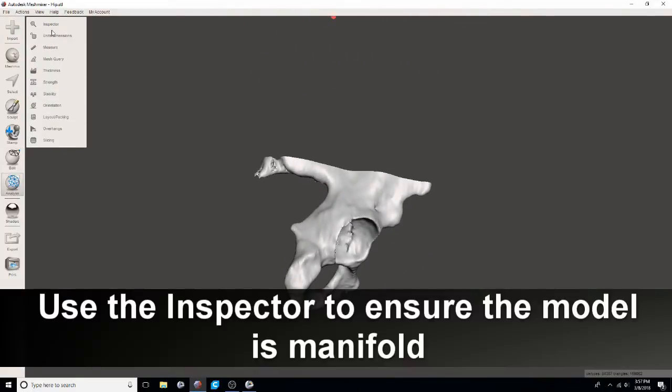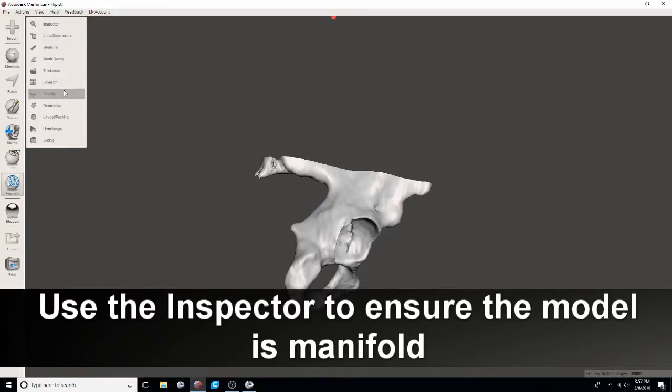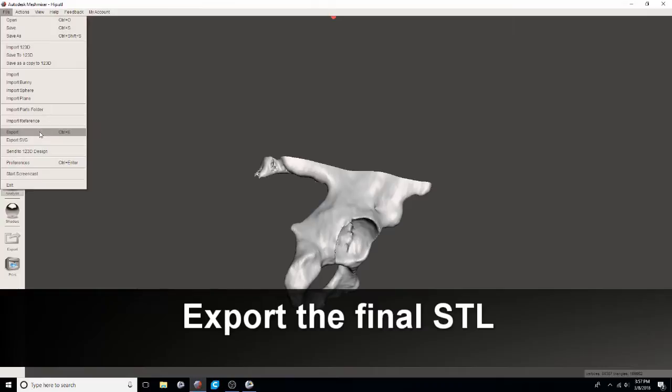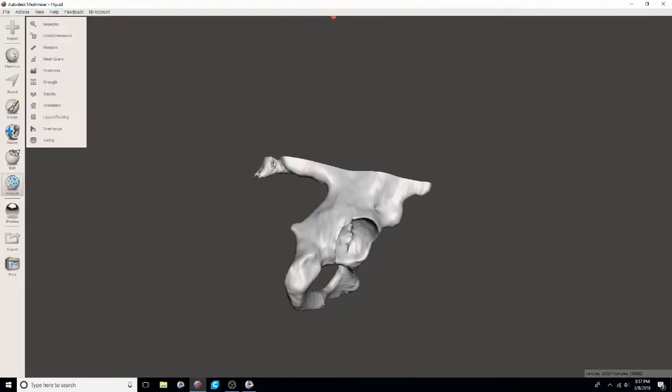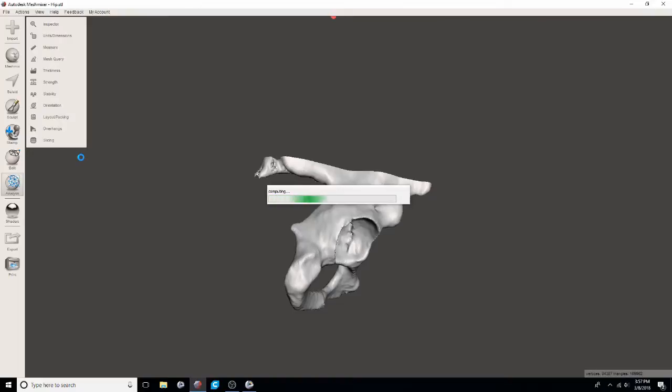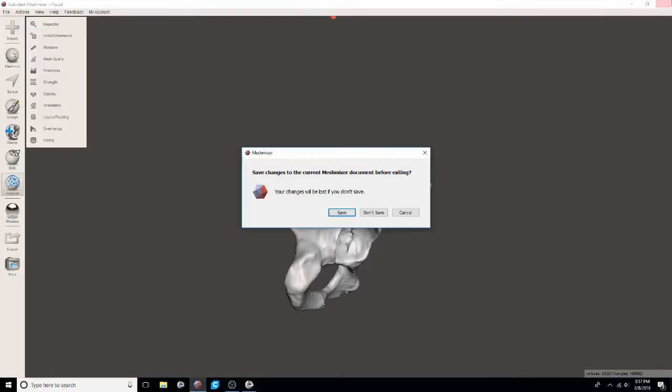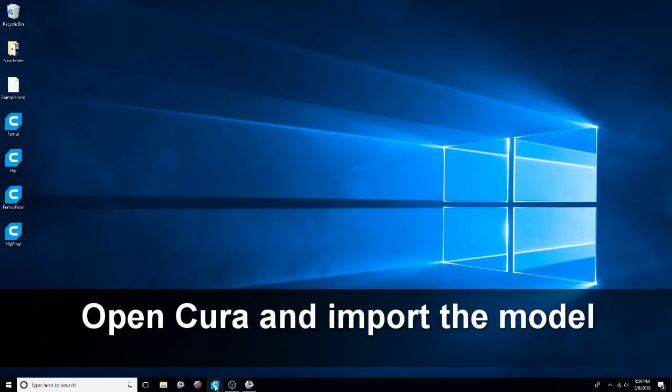Go into the inspector to ensure the model's manifold. With this method it typically is. But you just want to check that. Once it's determined to be manifold then you can export the final STL. I recommend saving all of those 3D slicer and the mesh mixer files so that you can later go back and edit them if needed.